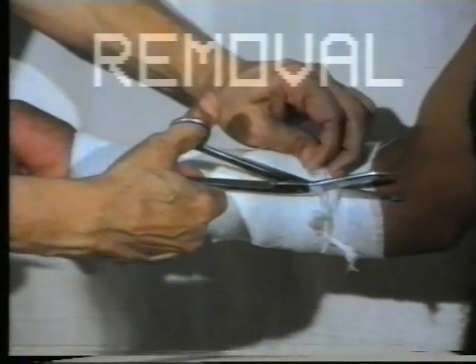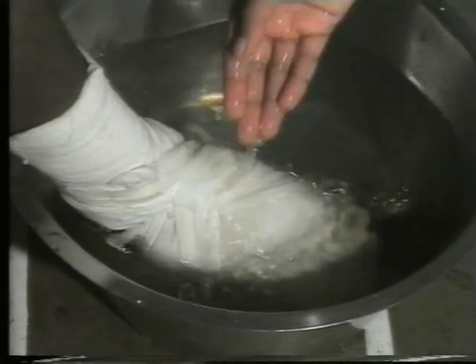Removal of bandage: first gently remove the sticking plaster or cut the knot if a knot is tied, and unroll the bandage passing it from one hand to the other, collecting it in a loose roll. Take care not to touch the dirty parts of the bandage. If the bandage shows dried discharge or blood it may be adherent to the skin and the wound, and its removal will be painful. So soak it in water and wet it before attempting removal, and note how easily the bandage and the dressing separate from the wound after wetting with water.